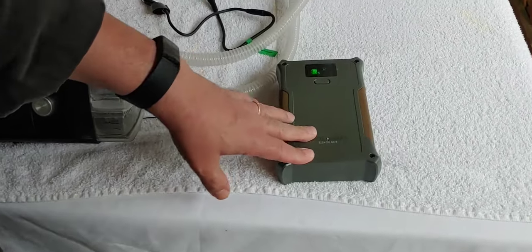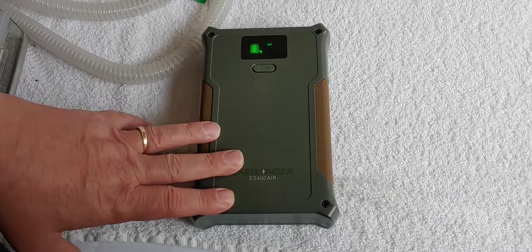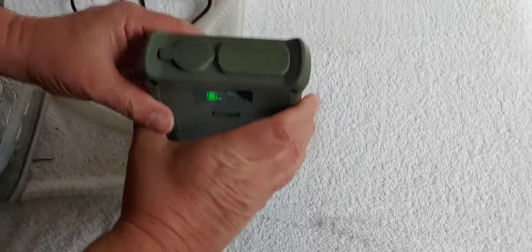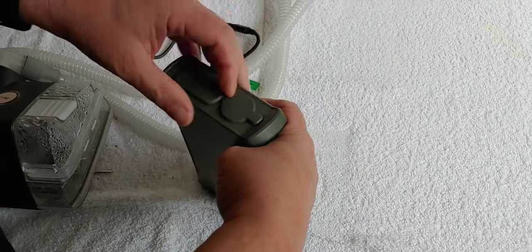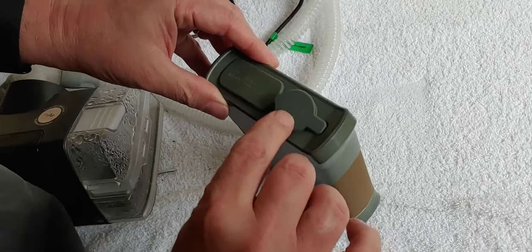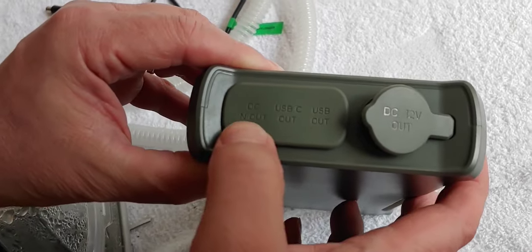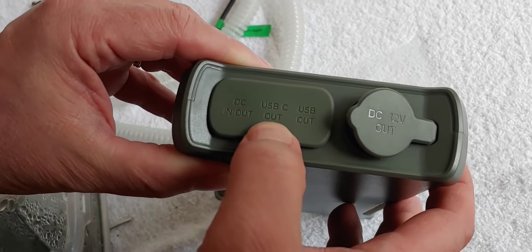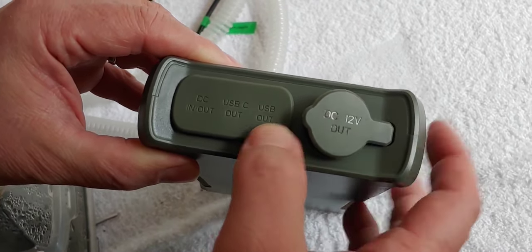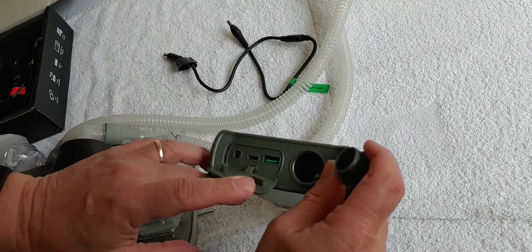Now that we have the ES400 Air all charged up, let's go ahead and talk about hooking it up. As we saw, there are several connections over here. Going through one more time: cigarette lighter 12-volt output, DC in and out, USB-C out, and USB out.